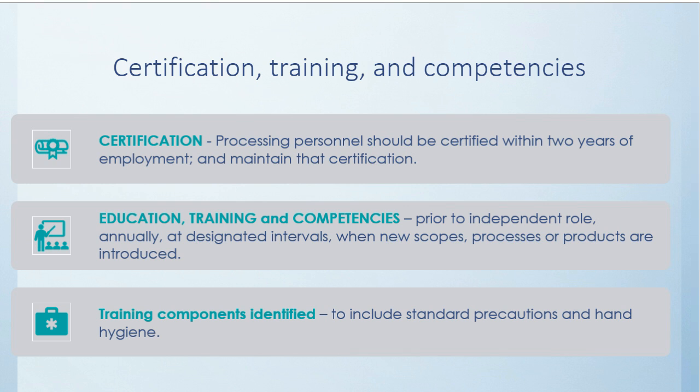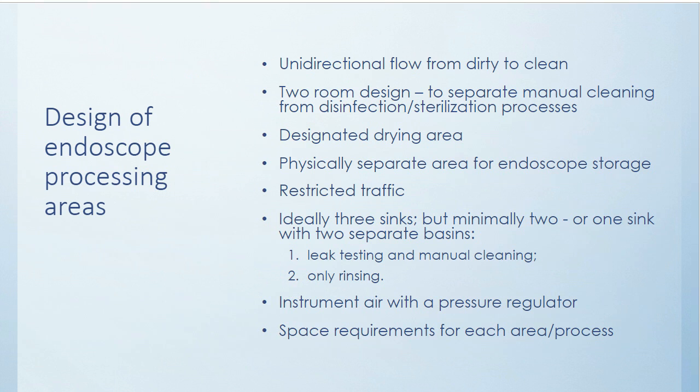We want to include the whole gamut of trainings that we would expect in endoscopy, anything from standard precautions, bloodborne pathogens, hand hygiene, all the different models of scopes, training on each specific one, our AERs, that's the automated endoscope reprocessors, any sterilizers. All of that needs to be included as part of the training program for any staff that is processing endoscopes.